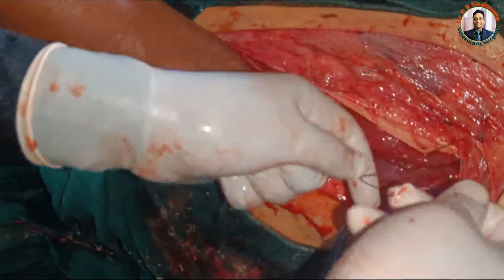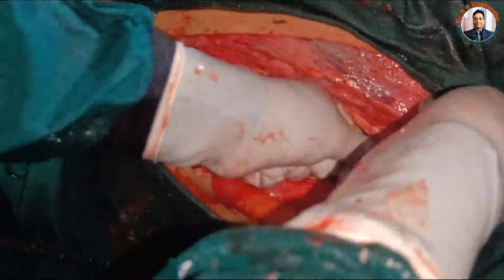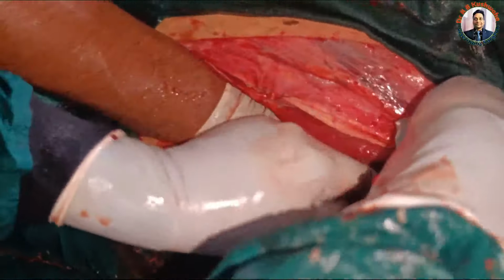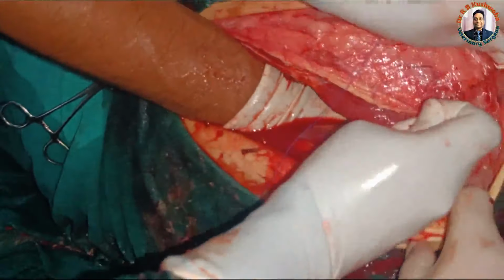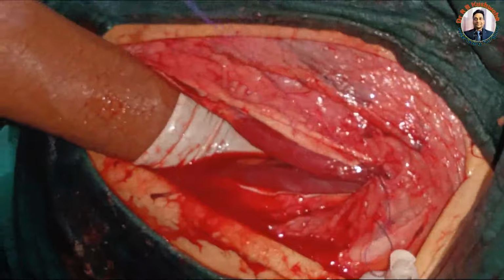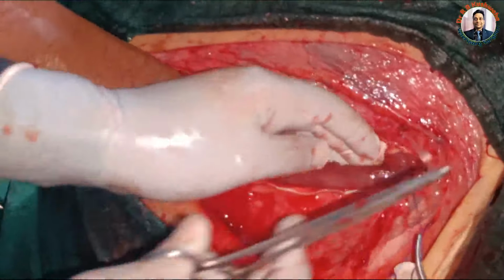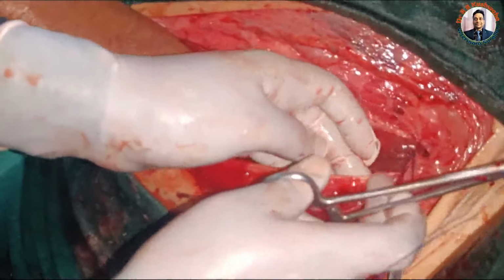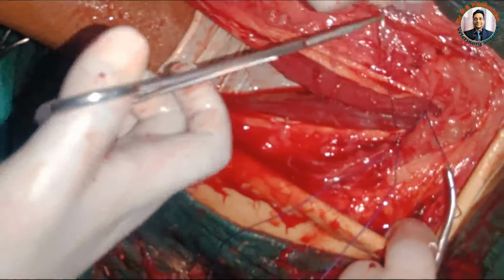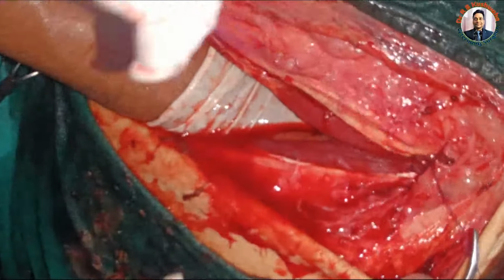This thread is still, otherwise ideally for this animal this suture material should be a minimum 2 or 3. Don't cut it. So we should practice that. Now you could see I applied, but still the aponeurotic part is far away. So without cutting the second edge, care should be taken, or you surgeon try to put this aponeurotic part together like this.